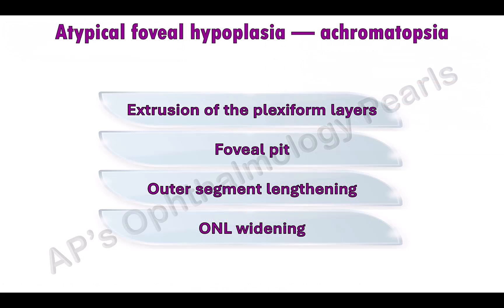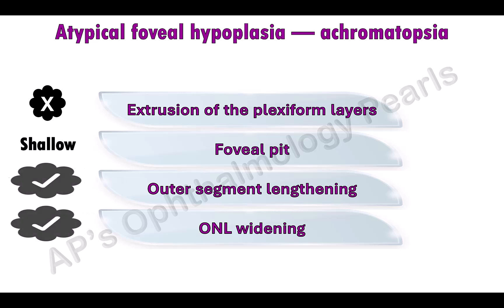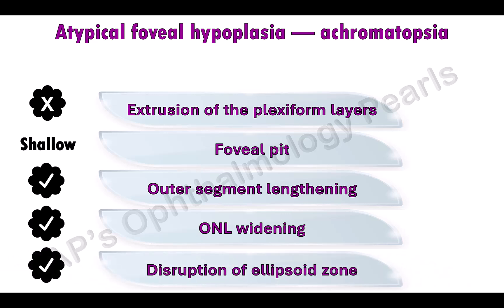The foveal hypoplasia that occurs in achromatopsia is atypical. The first two features are affected; however, outer segment lengthening and outer nuclear layer widening are normal. Instead, there is disruption of the ellipsoid zone indicating photoreceptor degeneration. There is also a significant decrease in retinal thickness and of the outer nuclear layers compared to normals.